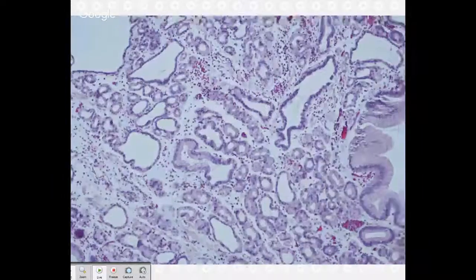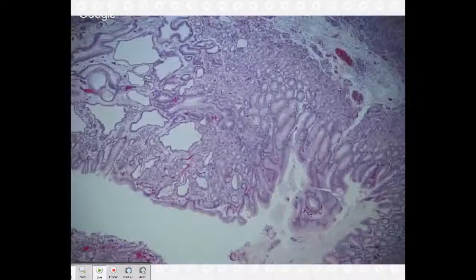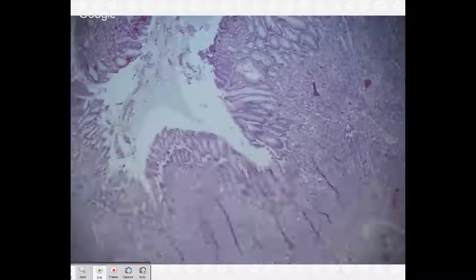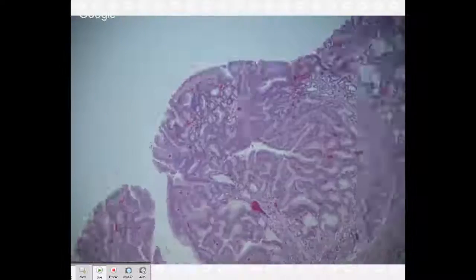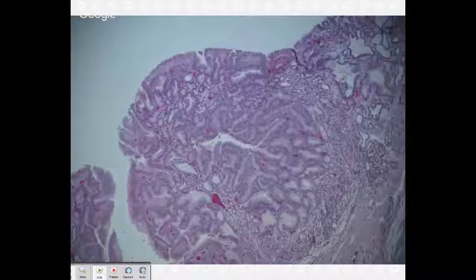We're in oxyntic mucosa, so having a fundic gland polyp is normal, almost. I mean, you get fundic gland polyps in up to 5% of your GI biopsies, and they're totally benign. But this one's been resected. So, leading question, did you find anything that you thought, I bet that's why they resected this lesion, besides the fact that it's just huge?